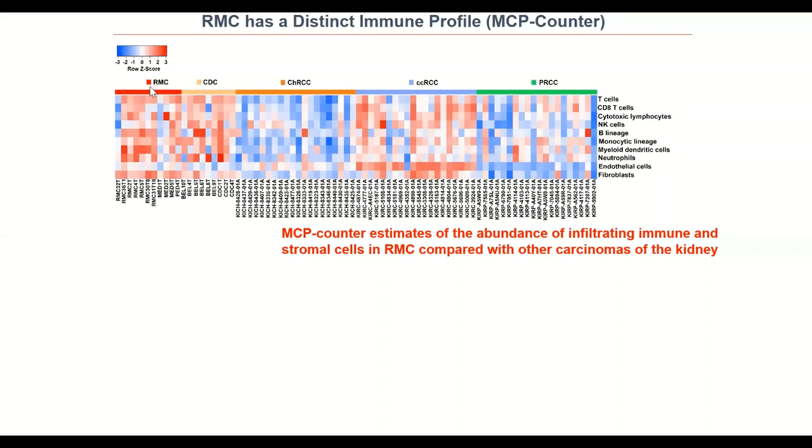And this just shows that for this RCC sample, all the indicators of immunotherapy are very strong compared against the other kidney samples. So this gives the oncologist, or clinical faculty, some insight to see if the immune therapy will work or not. Okay, so this just shows our basic science study, but it's actually highly related to the so-called clinical side.